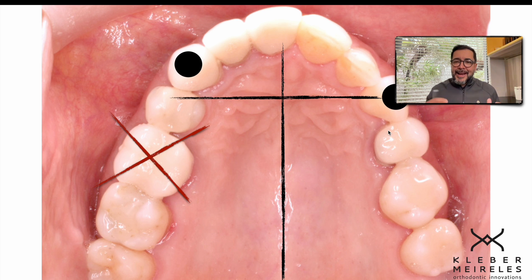I love loops, and it was well indicated here because I wanted to do things with more control, especially because I had a very large space to be closed. For activating the loop, I usually use geometry number six, which for me is better for controlling. And I deal with anchorage not by doing asymmetric positioning of the loop or the V shape, but mainly using anchorage for that.